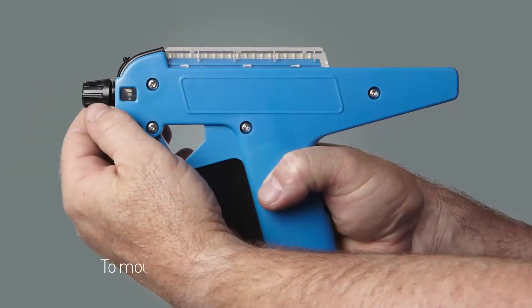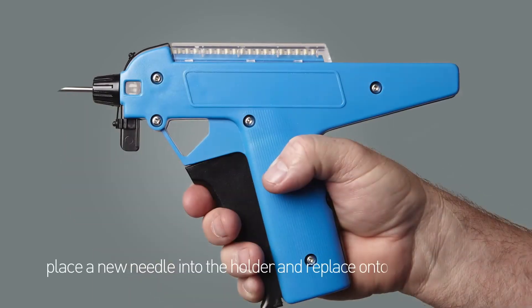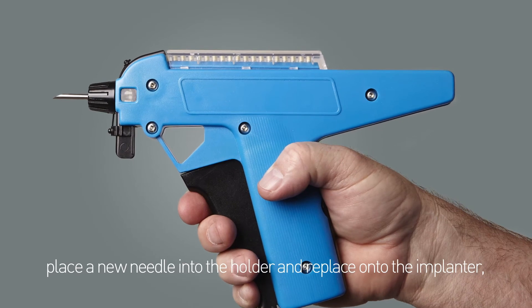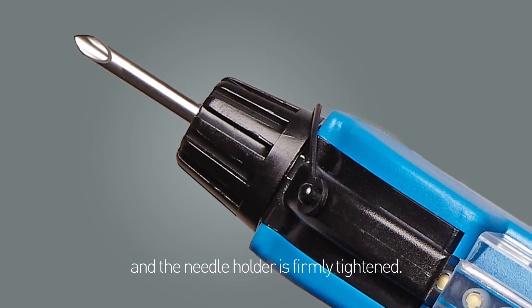To mount the needle, unscrew the needle holder, place a new needle into the holder and replace onto the implanter. Ensure that the needle bevel is facing upwards and the needle holder is firmly tightened.